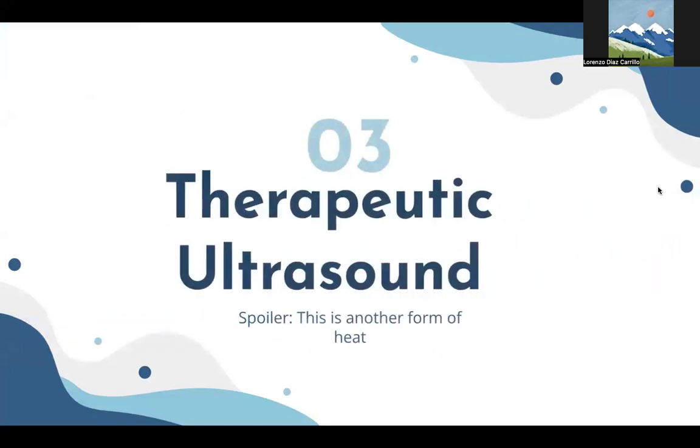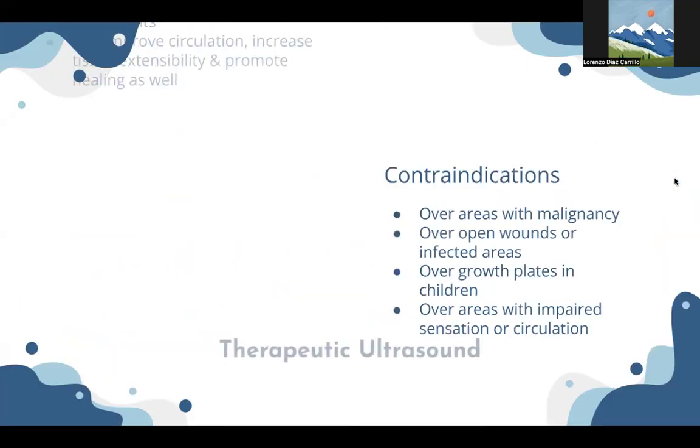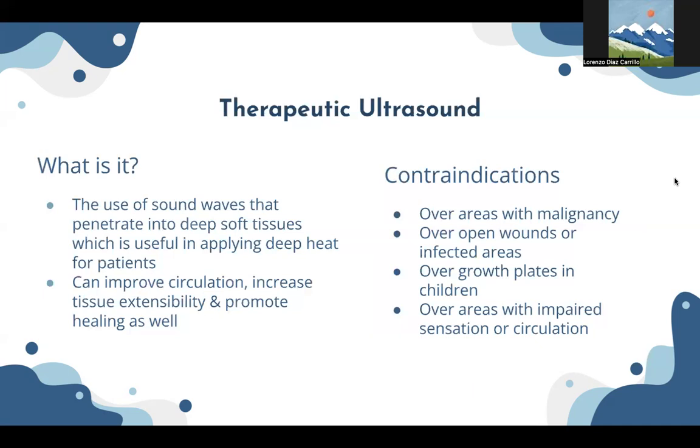And then last little section here is therapeutic ultrasound. And a little spoiler, it's another form of heat, even though it doesn't necessarily look like one. The science behind it, pretty crazy. The vibrating crystal on the inside. If you're familiar with it, amazing. If not, feel free to dive into the rabbit hole of how this machine works. It's very interesting, but I will refrain from going into it.